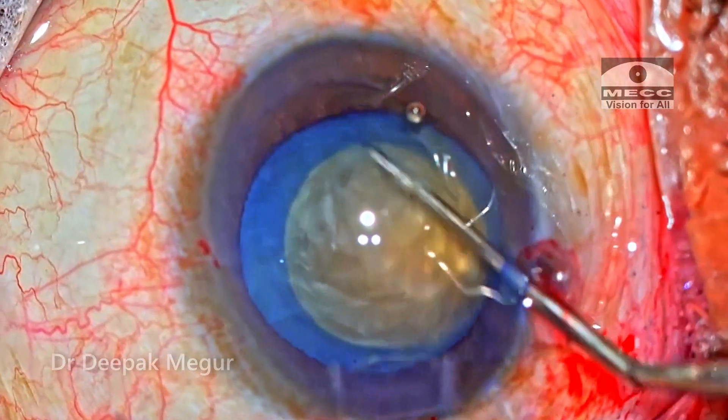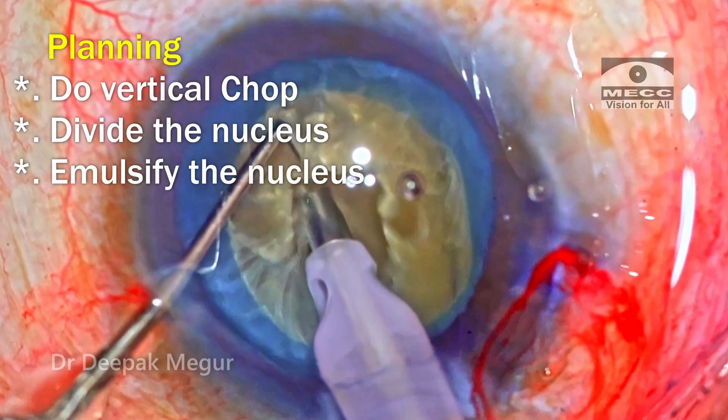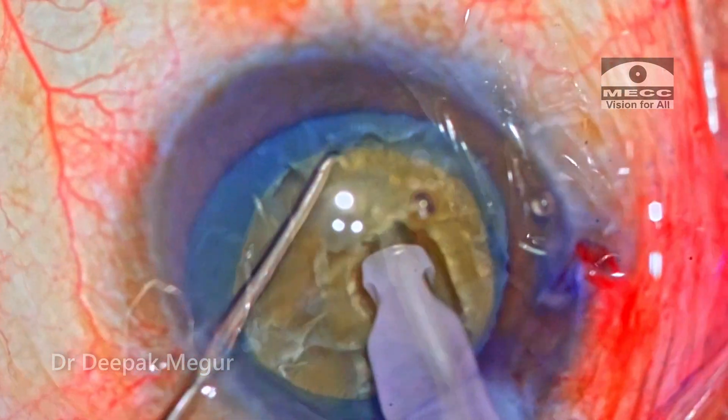I'm not expecting any surprises. The plan is the usual — planning to do a vertical chop, divide the fragments, and then emulsify each of them.